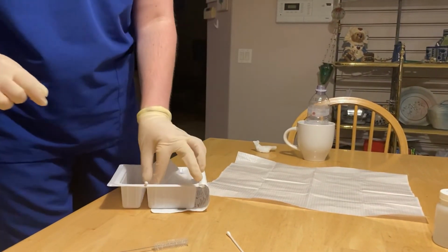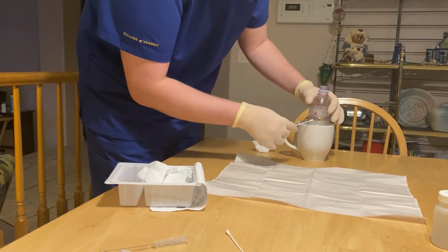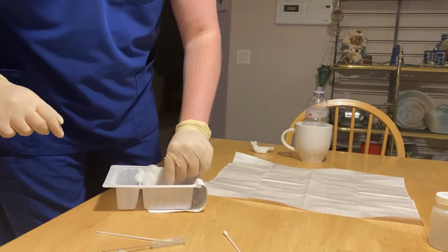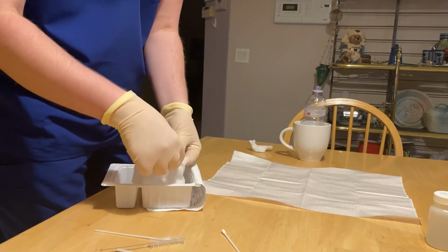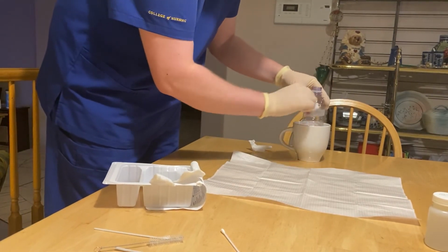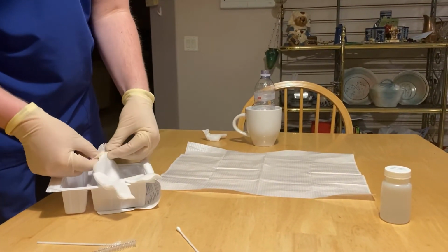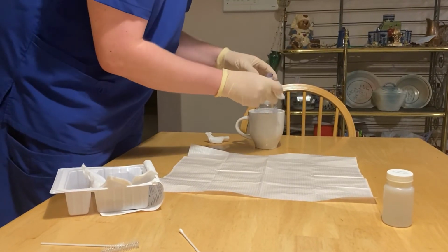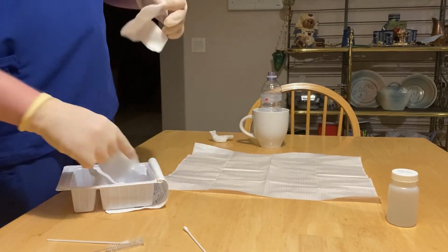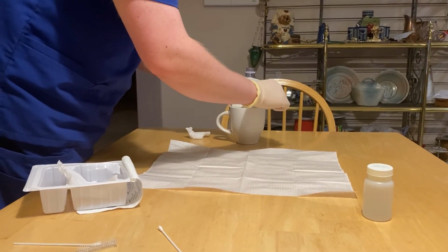I would take my Q-tips that I have here. I would then clean around the site, not inside the hole. I would clean around. And then I would take some gauze, not this fenestrated one. I'd take the gauze, clean around the outside, and then toss that. Use another one to dry around the site. And then I would replace the gauze around that.